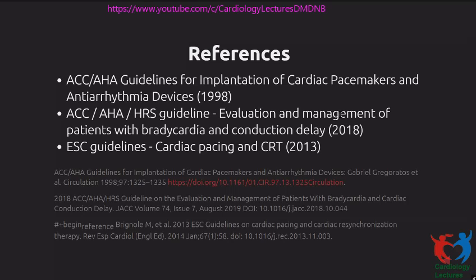It's an individual preference. You will see some operators who always go with His bundle first, some go with left bundle first. But again, you should be ready to switch. So at this point, I would say there's not enough to choose between either. You should know the pros and cons of each, and in individual patients, you have to decide based on the feasibility and the presence and site of bundle branch block in them and all that.